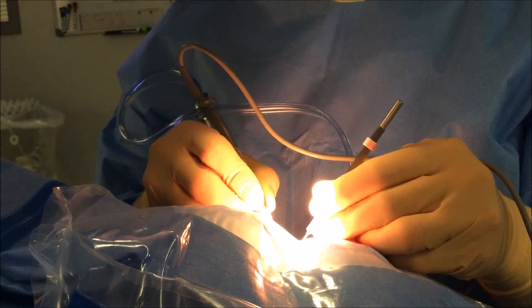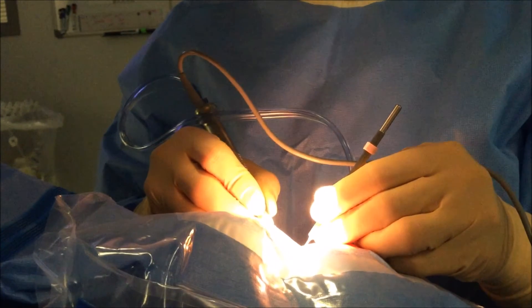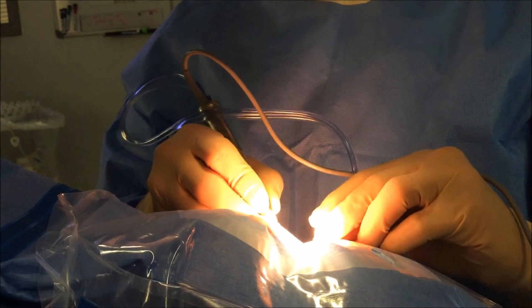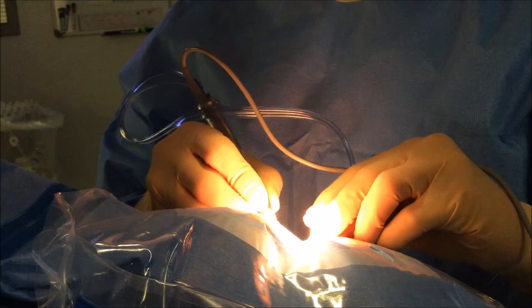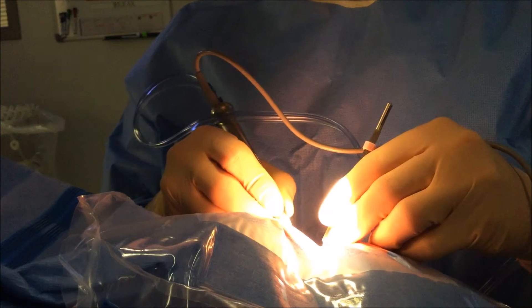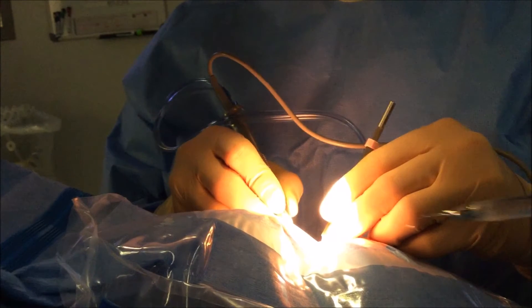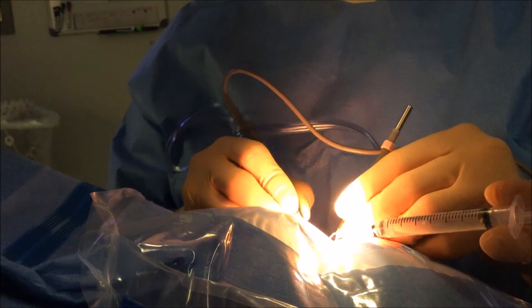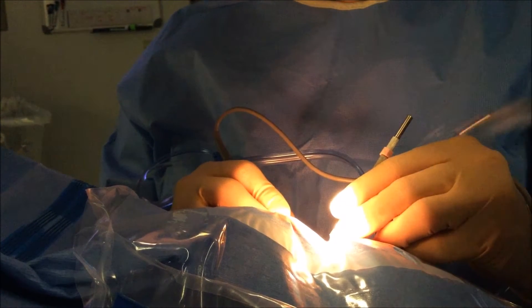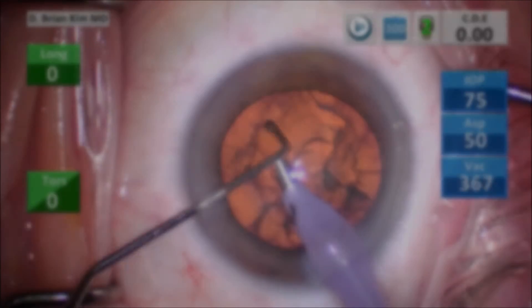I'm cracking the lens right now. Then I'm rotating my hand, pronating, sliding the chopper out to the equator again. Then I'm rotating it back, supinating. Now I'm ready for the cross chop maneuver. What's interesting is the facotip doesn't move at all for the cross chop. Now the facotip is being placed in a more neutral, downward — more horizontal — position, and that's when faco is initiated.